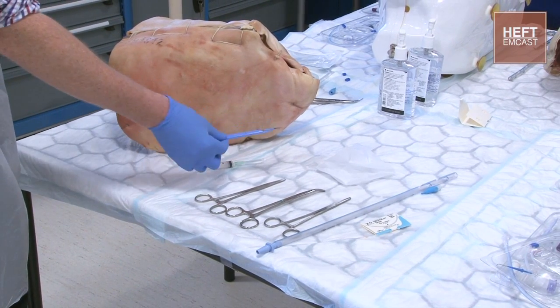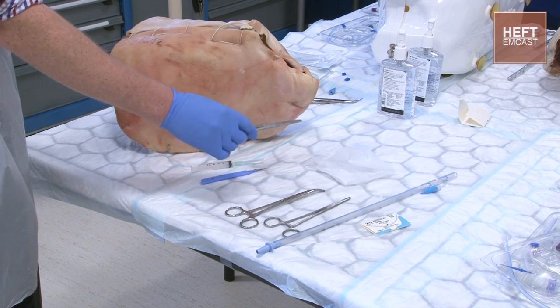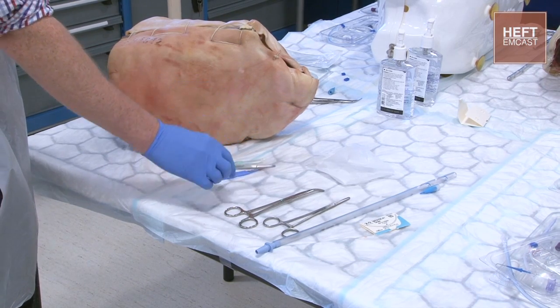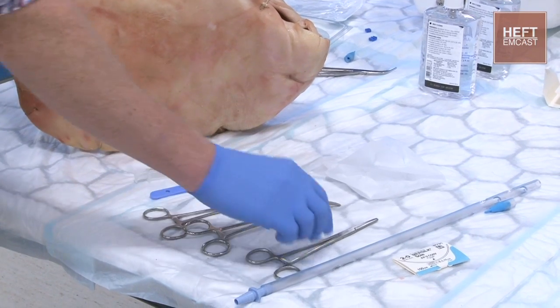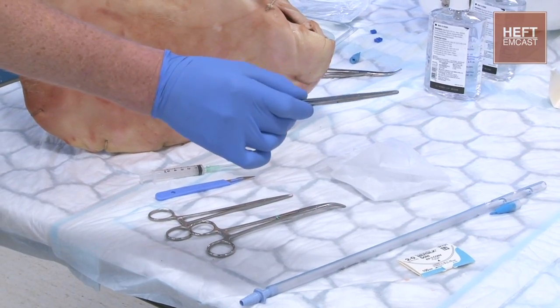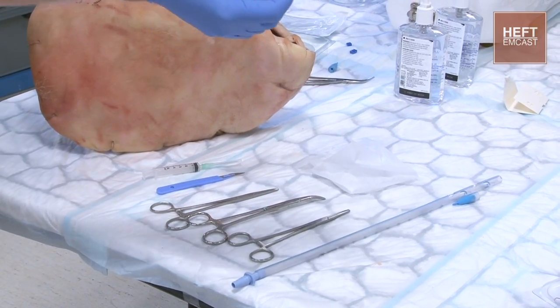You're then going to need your scalpel to make an incision into the skin. You're going to need a pair of forceps to do some blunt dissection. You're going to need something to hold your drain with, and then a clamp for your drain when you're inserting it. And finally you're going to need a suture to tie it all in place.